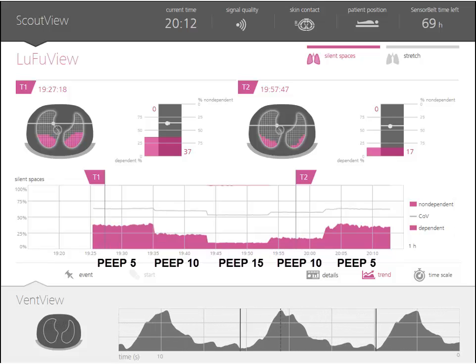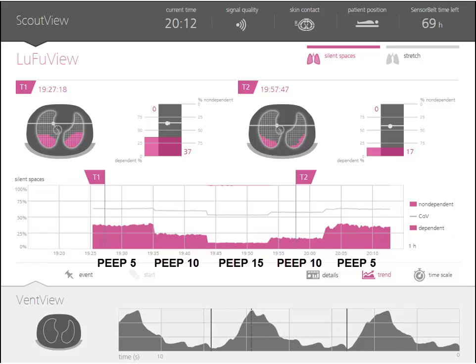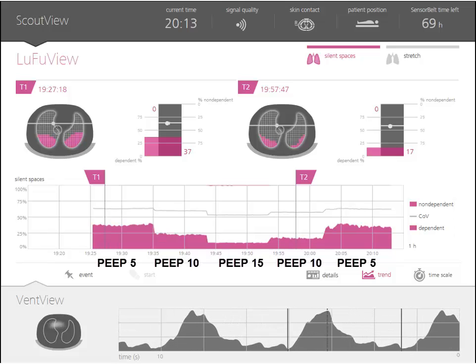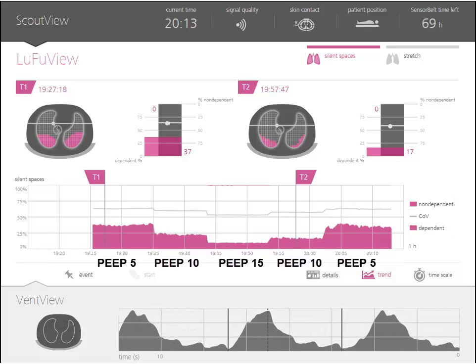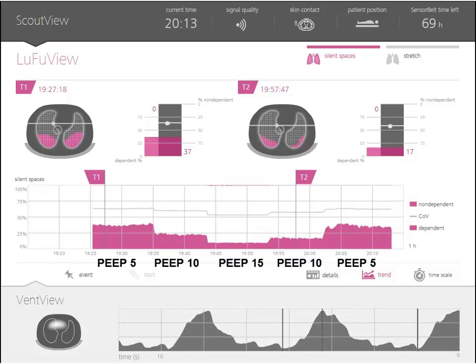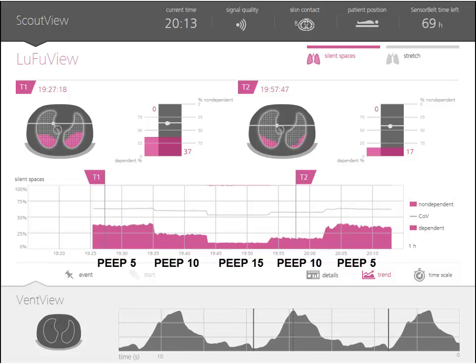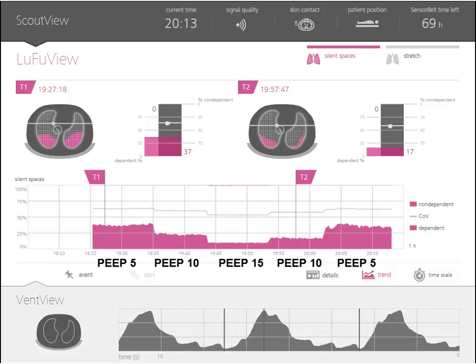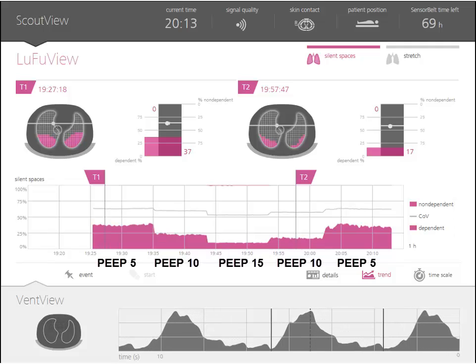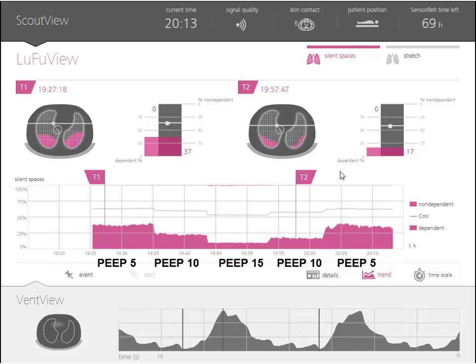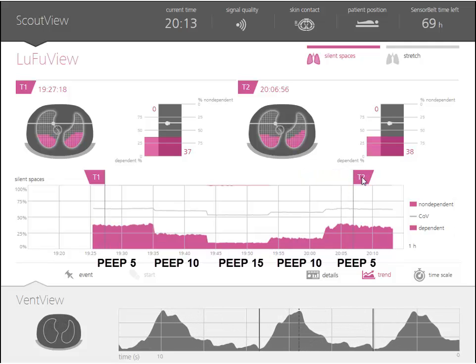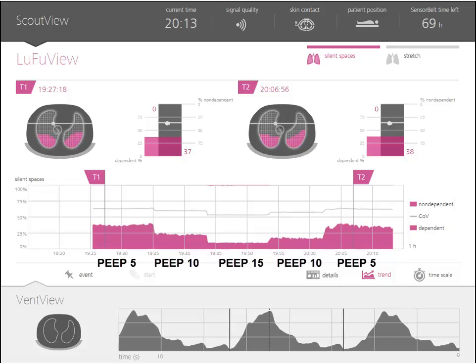Please note that the center of ventilation shifts centrally after applying recruitment and an adequate level of PEEP. All of the above EIT findings indicate an open lung condition at PEEP 15 cm of water.